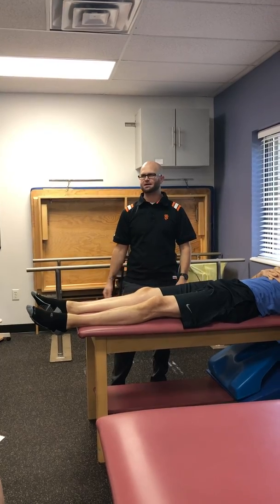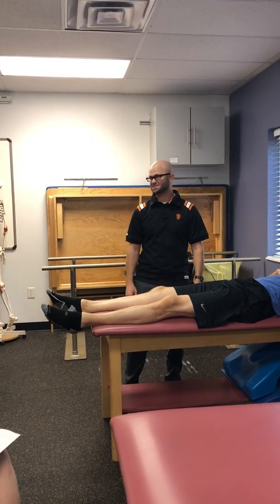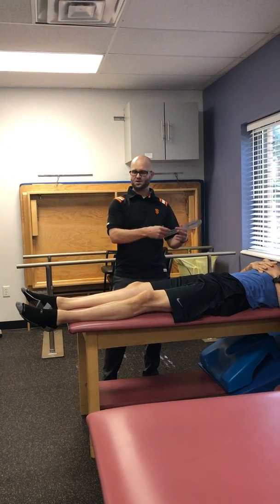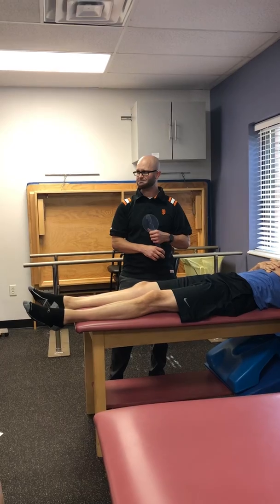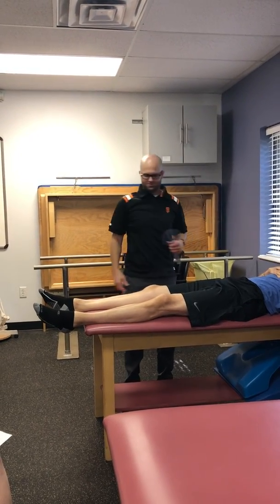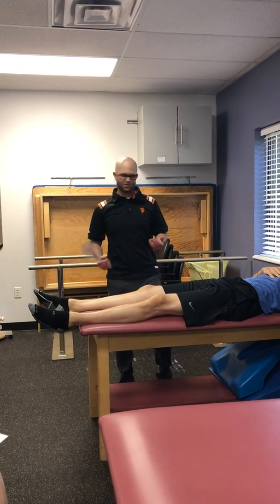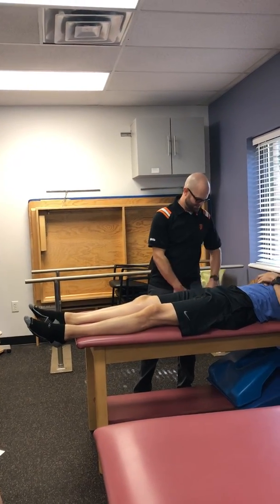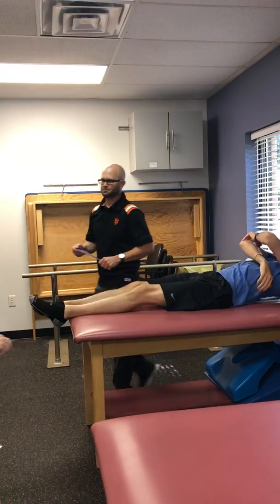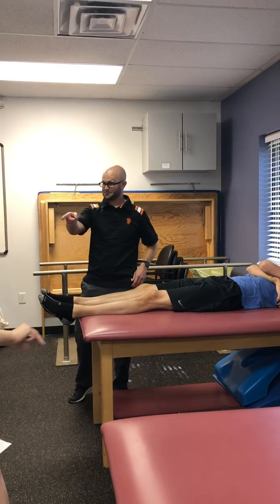So how do we get around that? Drop the leg off the table. Could. He might not be very comfortable doing that. Put them on their side, then it's going to be hard to line up our goni, right? And lift the leg, it's going to be like hyperextension all over again. Angle them. Angle them! We could. I want you to slide to this side now. I thought for sure you got it right. Would you have the other leg go towards that?